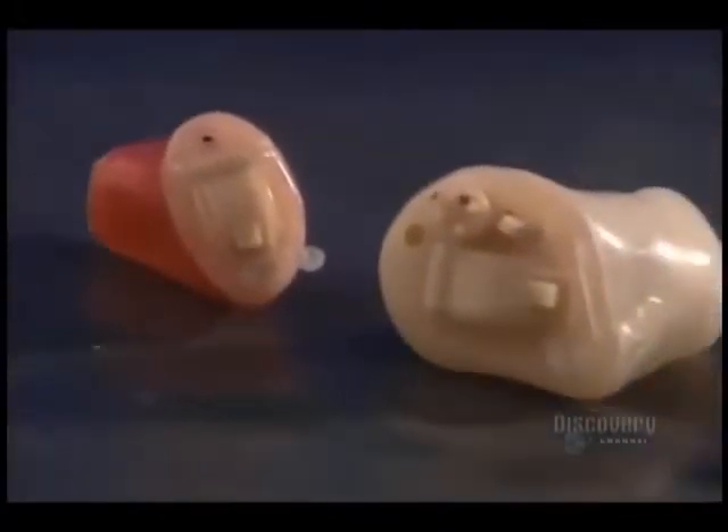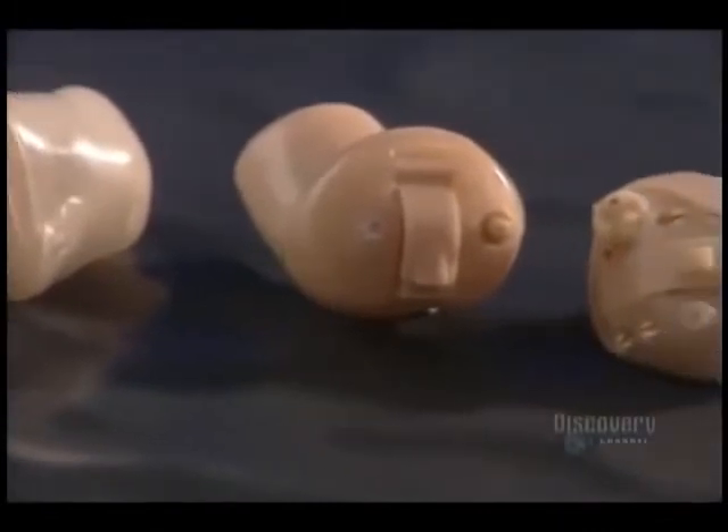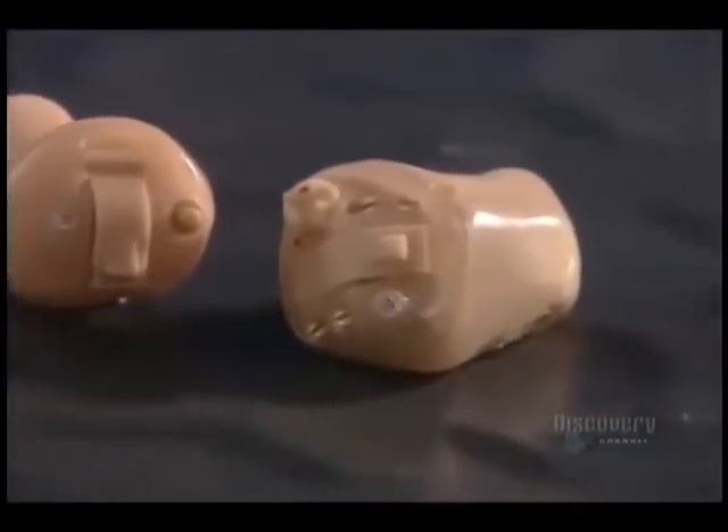These minute prostheses allow us to solve the main hearing problems. Micro-fabrication of a single unit requires a little more than two days of work.